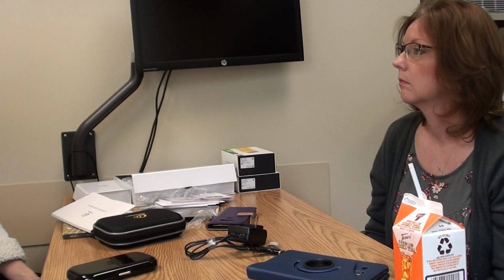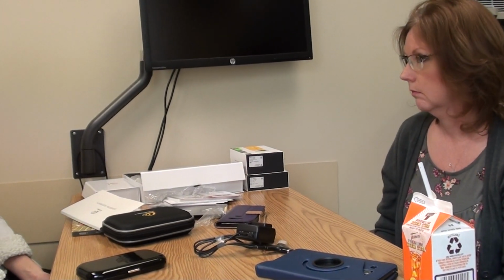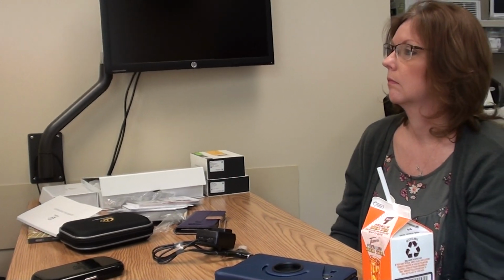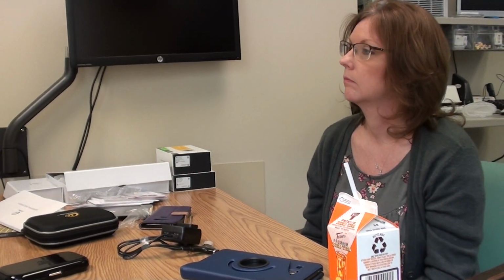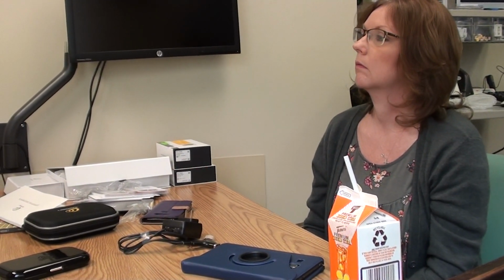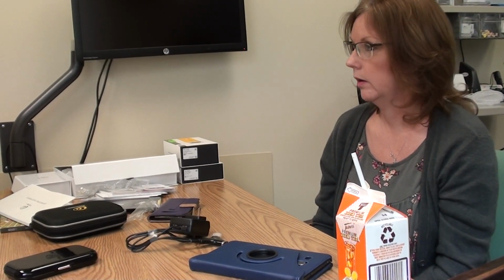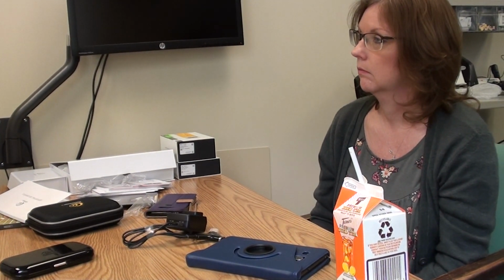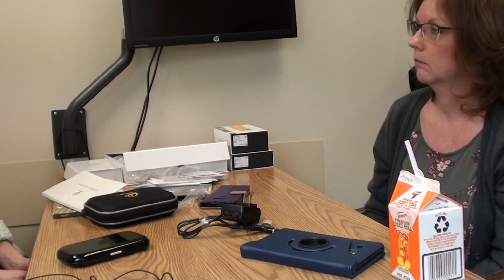So I want you to try to stay in 1, or if you feel like you're adapting to this, like she said, go to 2 or 3. But try not to go backwards to number 4 to make it softer unless you really feel like you have to, if something's really too loud. Okay. But try to avoid using that one, if you need it.